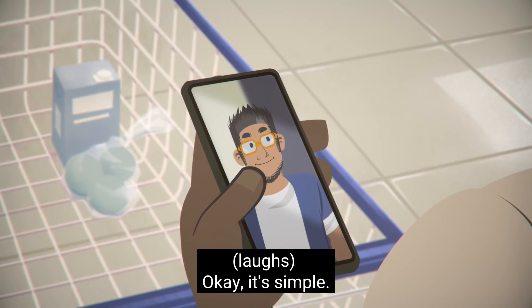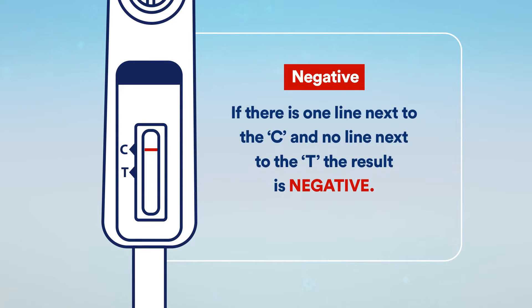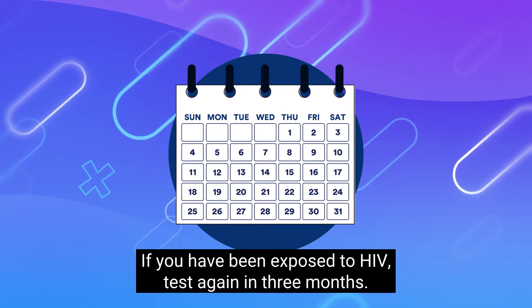Okay, it's simple. If there is one line next to the C and no line next to the T, the result is negative. Seek regular testing. If you have been exposed to HIV, test again in three months.